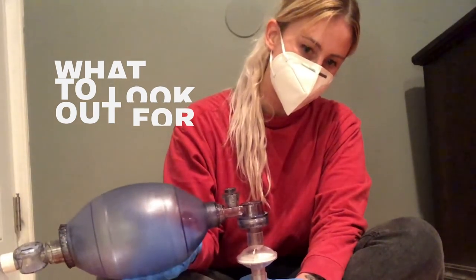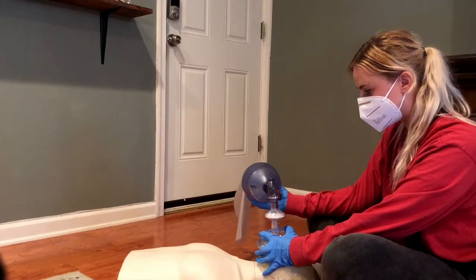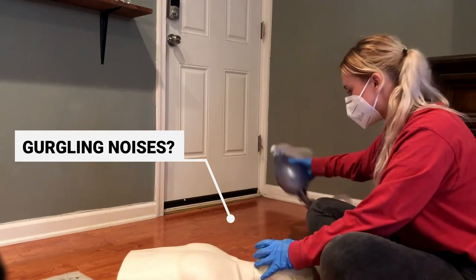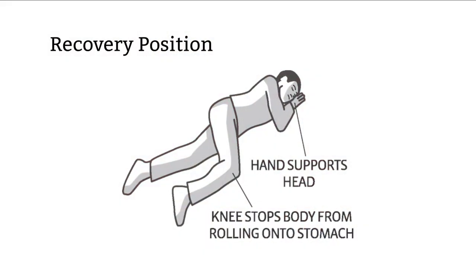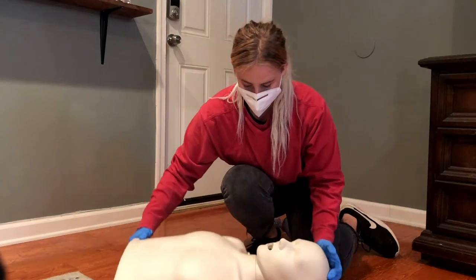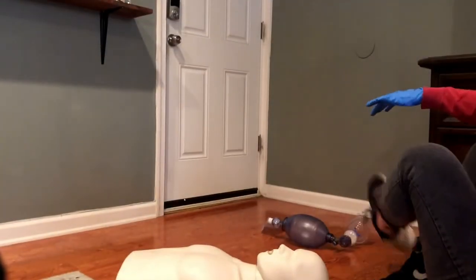Be sure to look out for gurgling noises or other signs that the person may vomit. Sometimes this happens once the Narcan is starting to take effect, but before the person is conscious or breathing on their own. If a person is making gurgling noises, flip them on the side in the recovery position until they have vomited or until the sounds have stopped. Then put them back onto their back and continue rescue breathing if they're still not breathing on their own.